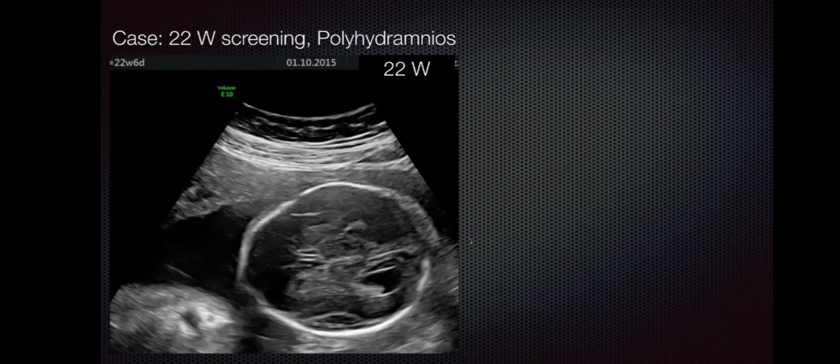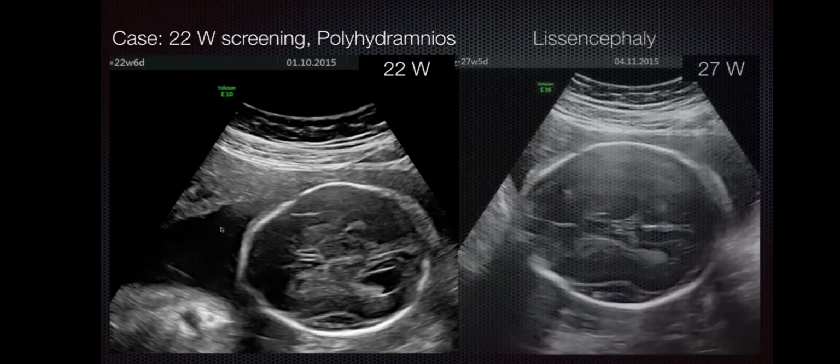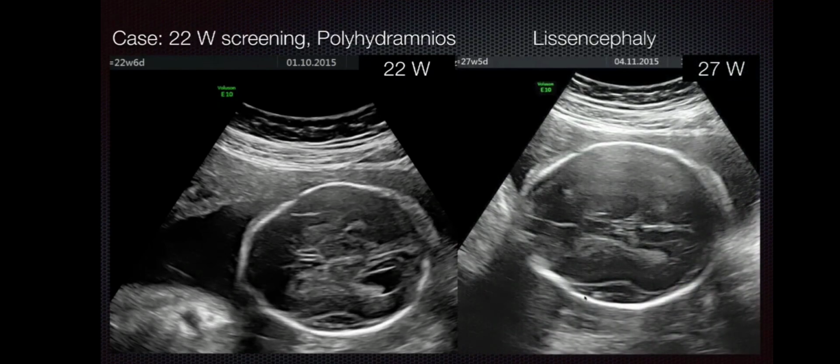This is at 22 weeks. At that time, we said the brain looks normal. This was okay, but because of polyhydramnios, which is not rarely found in cases of lissencephaly, polyhydramnios is also observed. We don't know what the etiology is. The same fetus at 27 weeks, you see there is no square shape, and this is typical lissencephaly.